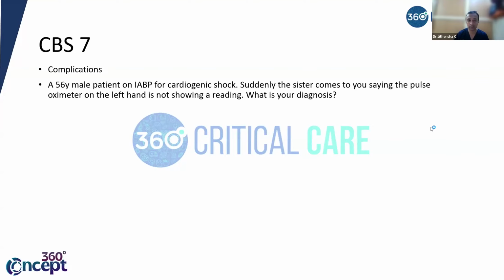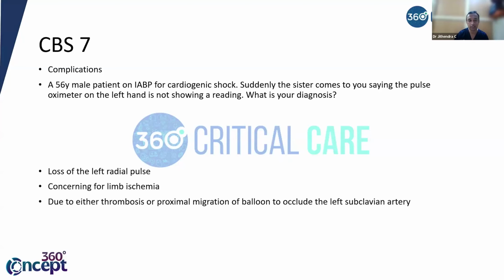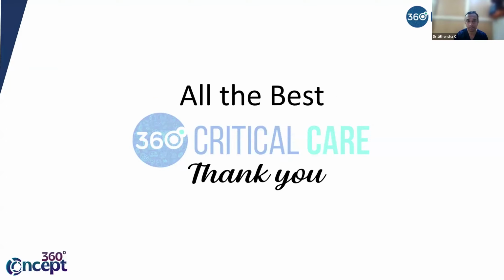So that is not alone the answer. One is malposition, as everybody says. The other possibility is there can be a thrombus. Correct. That is another answer. Your first answer is definitely malposition. That is what you'll be thinking. So the next answer is you should think about any thrombosis happening, which should also be taken care of. Mainly we are looking into something occluding the left subclavian. Either it can be the balloon because of malpositioning, or it can be a thrombus which is formed because the balloon is sitting there for a long time. Okay. These two are the answers you can expect.